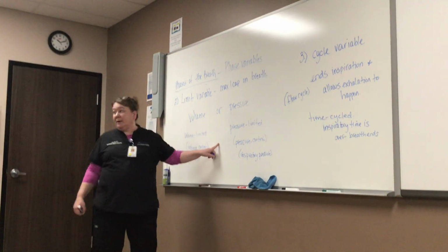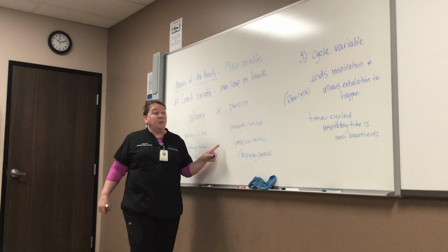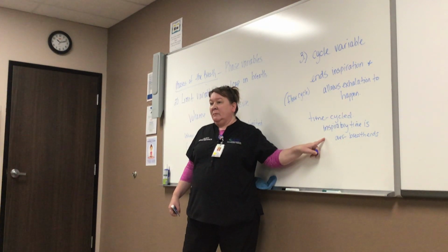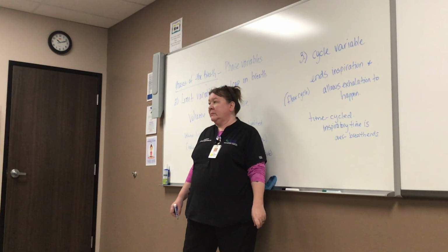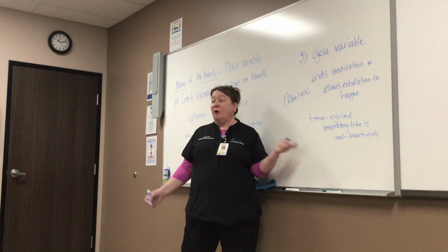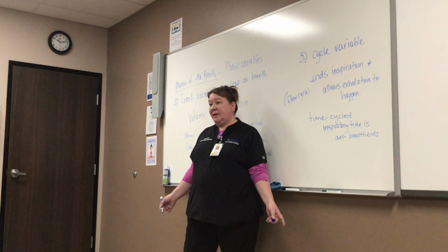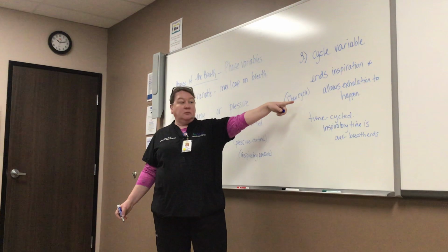This does not end the breath. Just because you reach your tidal volume doesn't mean the breath is over. The breath will not end until your inspiratory time is over. Does that make sense? So volume limited, time cycle, volume control. It's just saying that when inspiratory time is over, the breath ends. Just fancy words for what's happening. But that's how we tell the ventilator what to do.